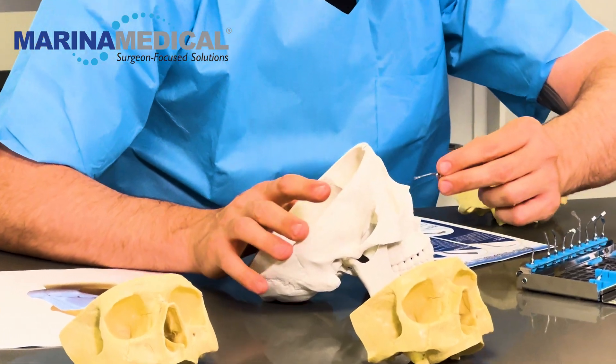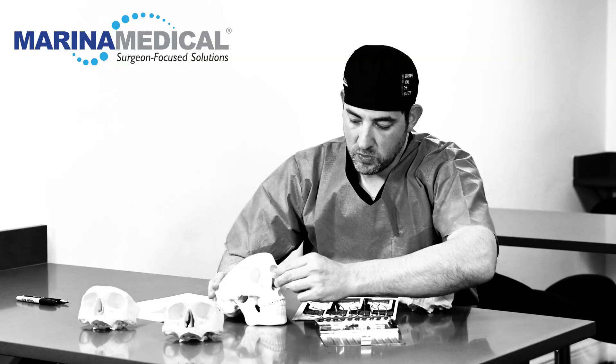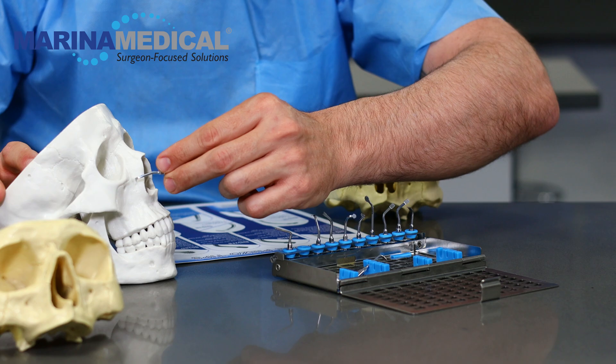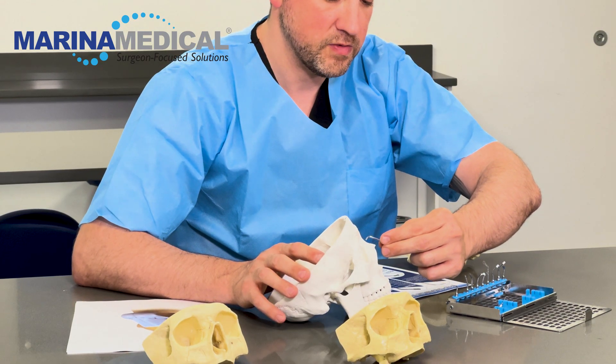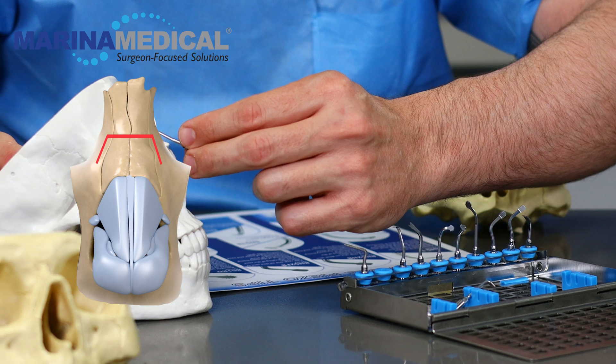I use these saws to make the lateral osteotomies right through here, whether you want a low to low, low to high, or high to high. This tool also can be used to create transverse osteotomies if you're doing preservation rhinoplasty.